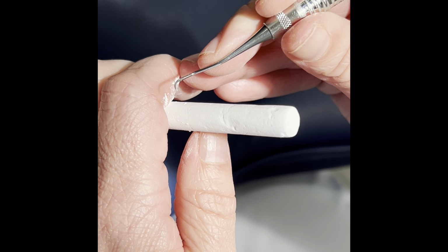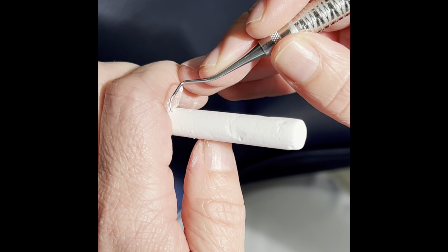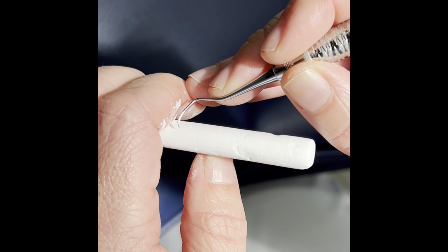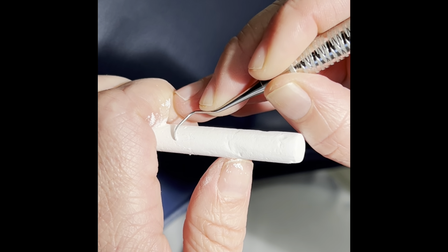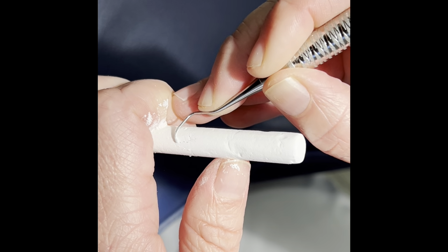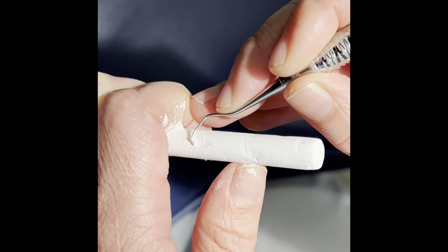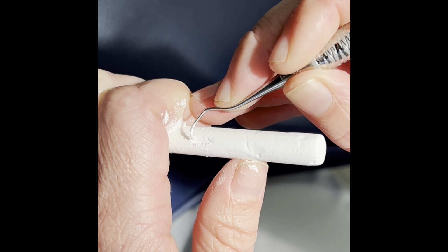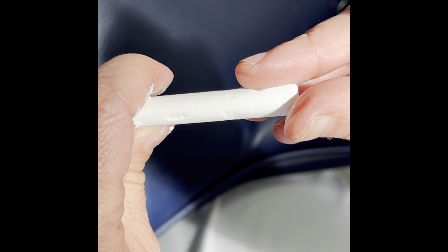And when you do a root debridement stroke, you're going to have light to moderate pressure. You should have a shallow linear groove made in the chalk. So that would look something like this. So not as much pressure as the calculus removal stroke, but more pressure than an assessment stroke. You can see the chalk is coming off, but a longer linear stroke. So your chalk will look something like this at the end of that.